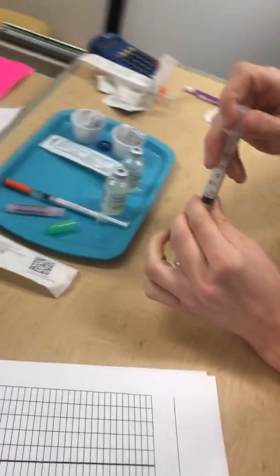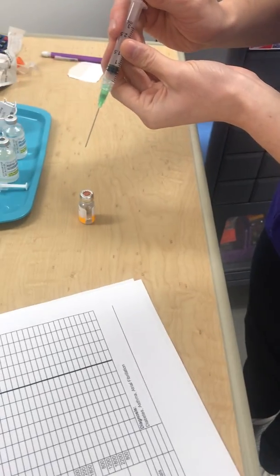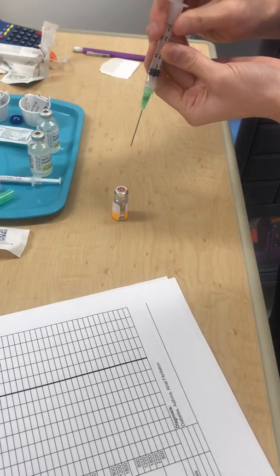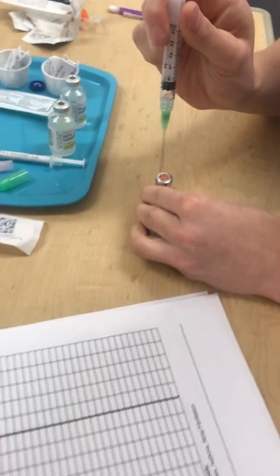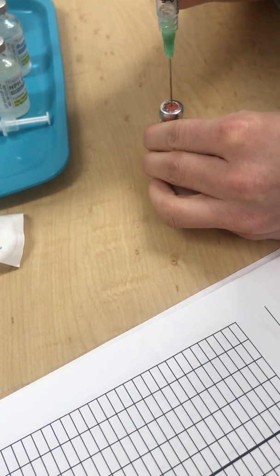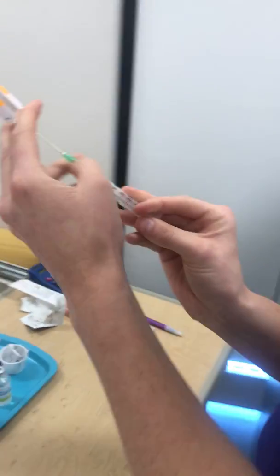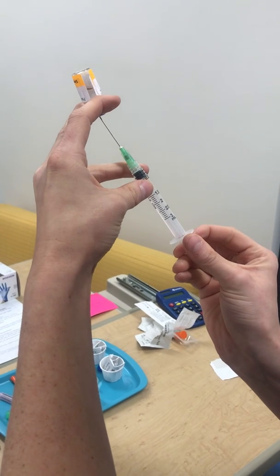Oh, looks like this might have moved on me. Okay, so there. I'm going to inject my air. Okay, and then I'm going to tip up, and then I'll pull back.